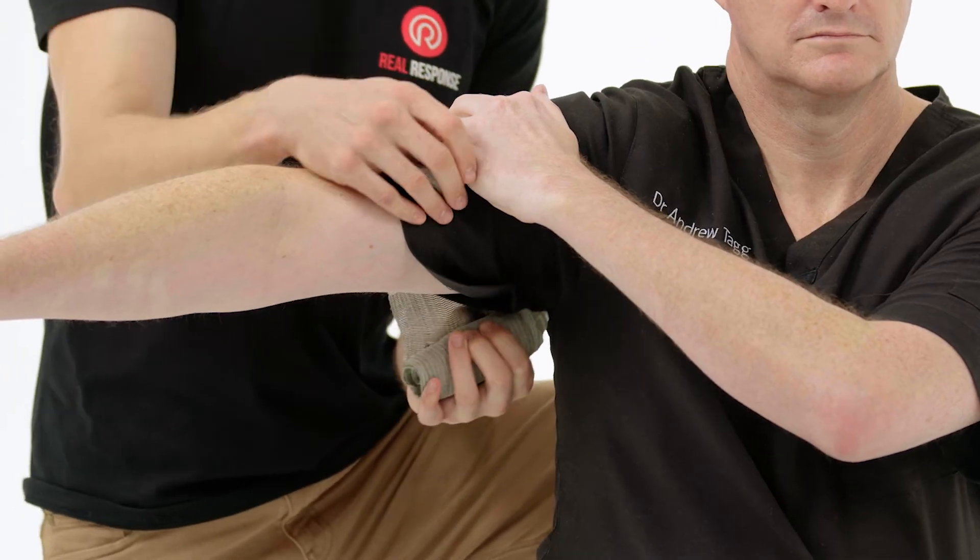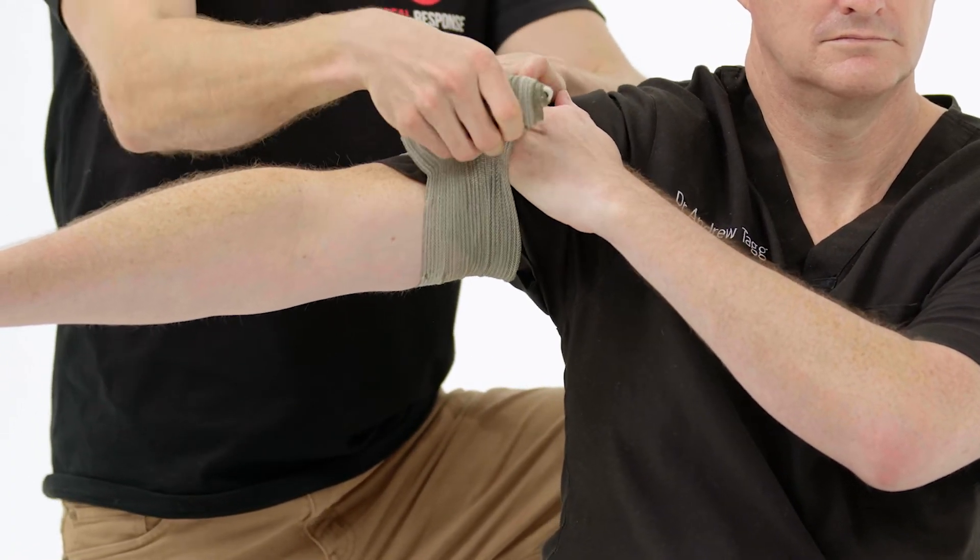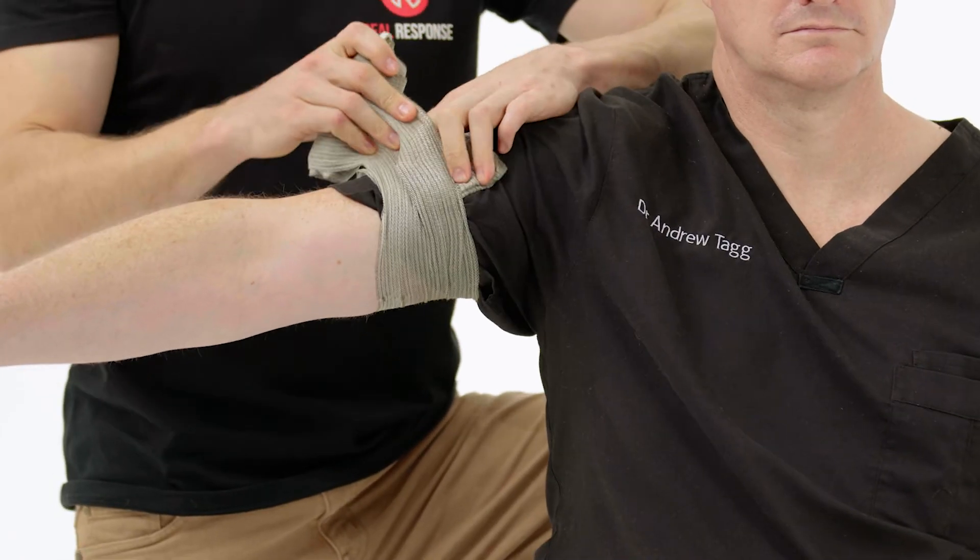From here, ask the patient to raise their arm for ease of application and then attempt to wrap the bandage around. Once you get to the hand, just push their hand out of the way and apply the pressure yourself.